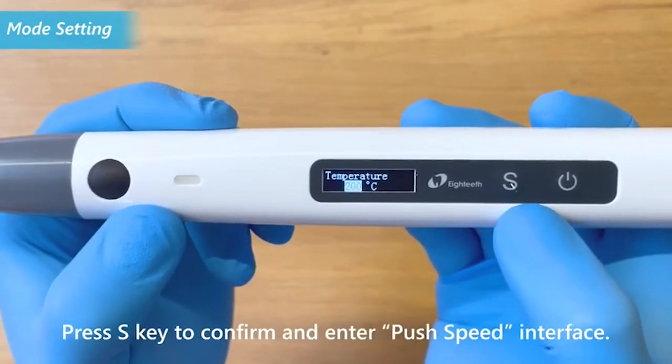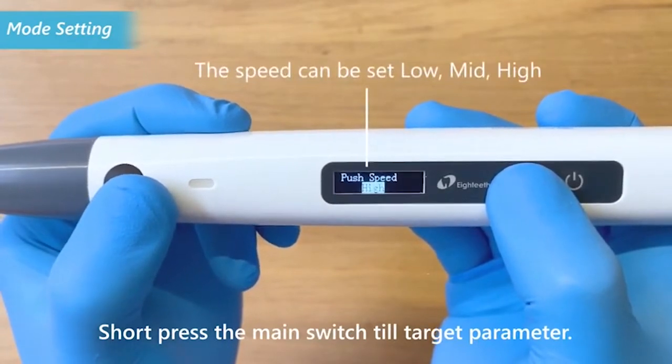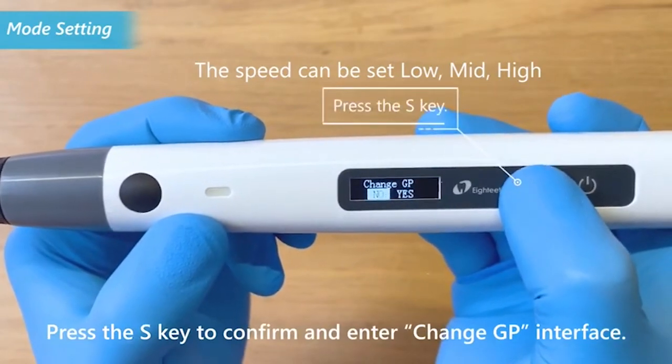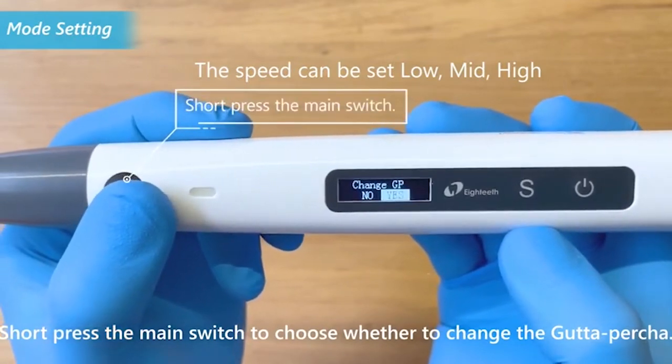Press the S key to confirm and enter the push speed interface. Short press the main switch until the target parameter is reached. Press the S key to confirm and enter the change GP interface. Short press the main switch to choose whether to change the gutta percha.